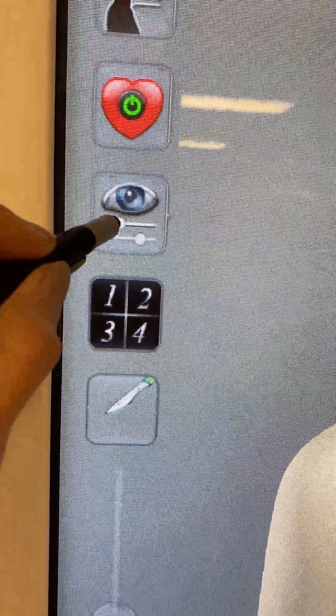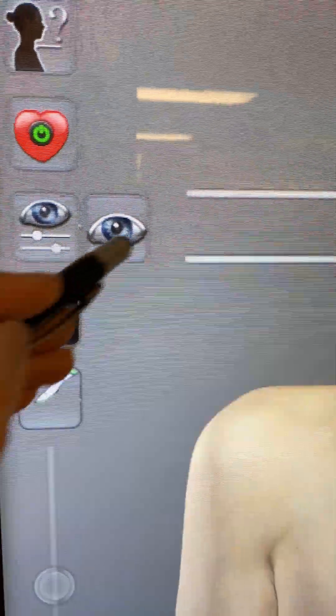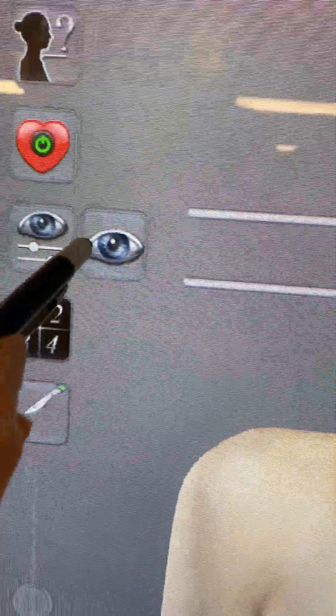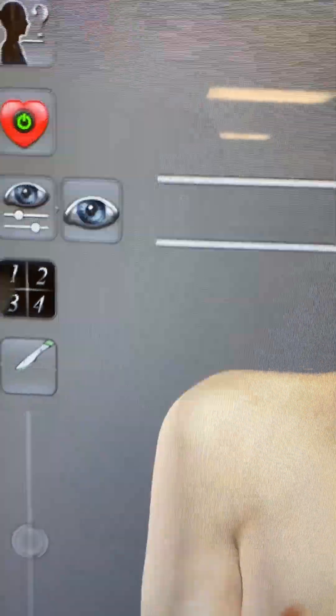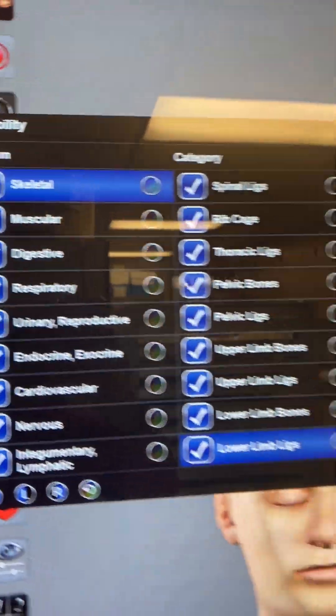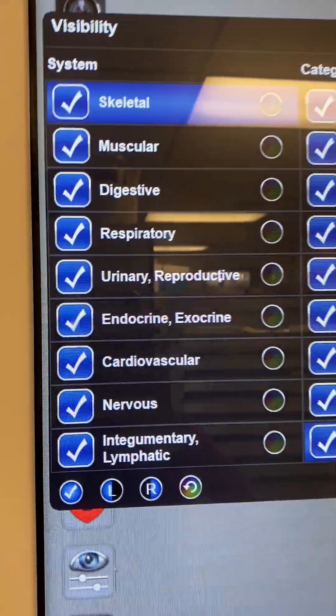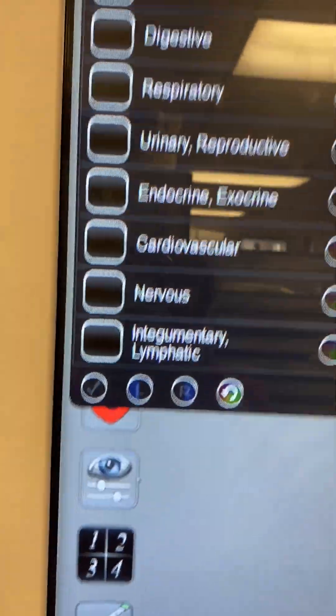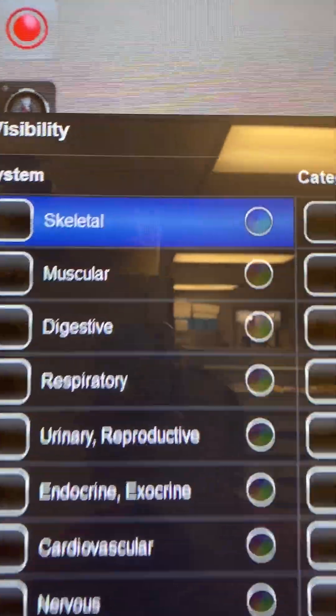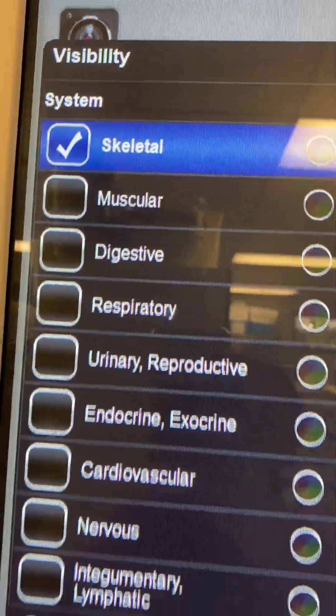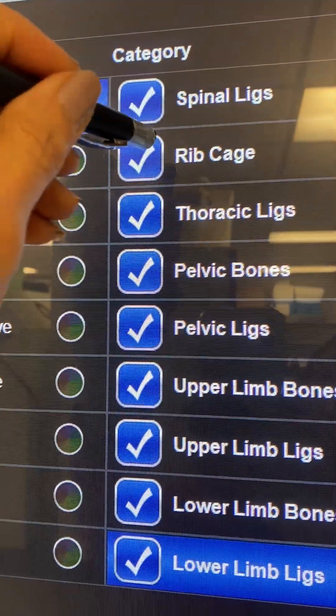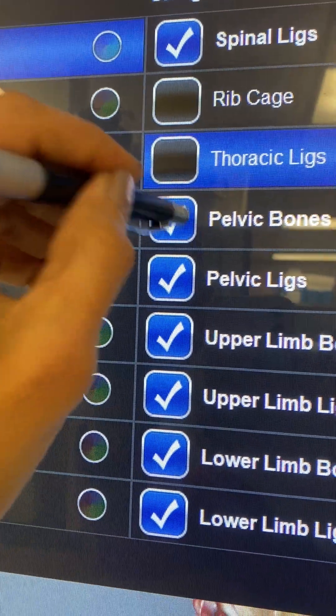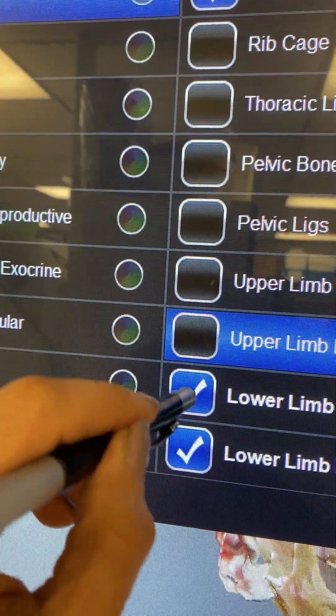You can watch my other video about the visibility menu. Tap on the eye icon here and the systems of the body appear. I can remove them and the cadaver is gone. Choose just the skeletal system. You can remove all the parts. I'm just going to use the skull.